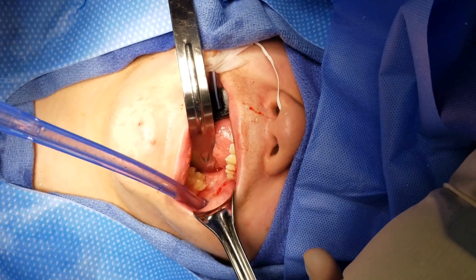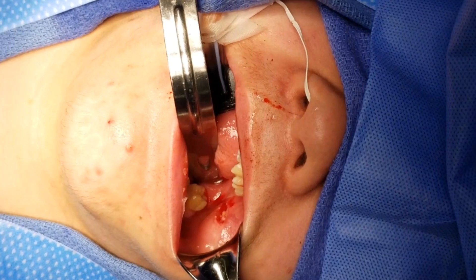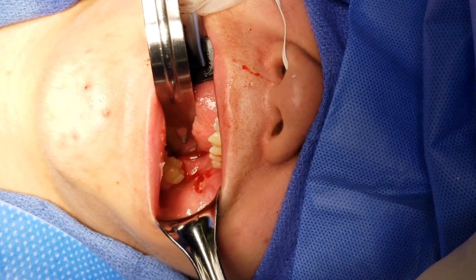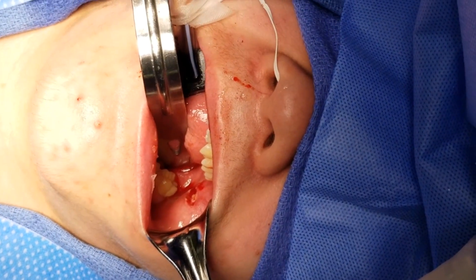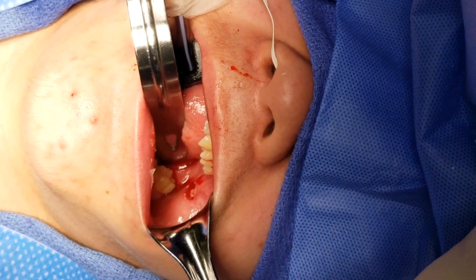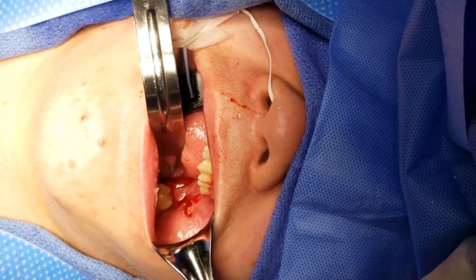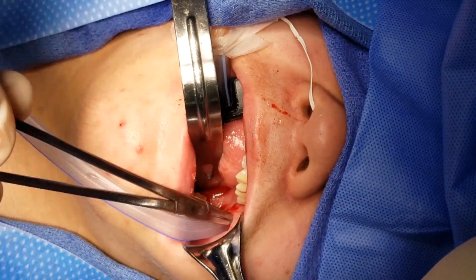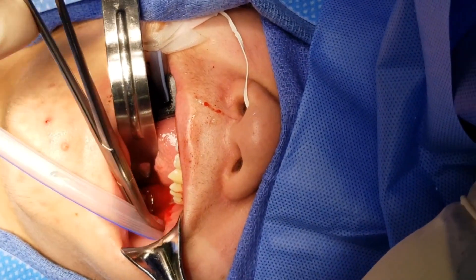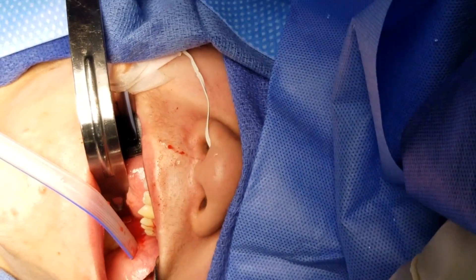I'll take a Penrose. Thank you. Wow, this is a different Penrose. That's a Penrose? They gave me... Hmm. Apex-free Penrose — is that what those are? I haven't seen one of these. Oh, look at you. Look at the big brain on you. I'm like, is that okay? No, no, it's fine. I'm just showing my ignorance for the world. What the heck is this? All right, I'm going to have a suture, please.